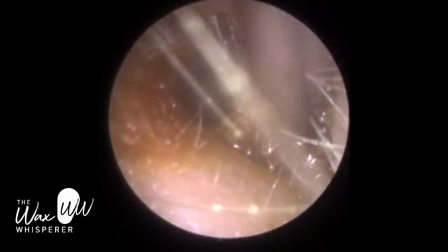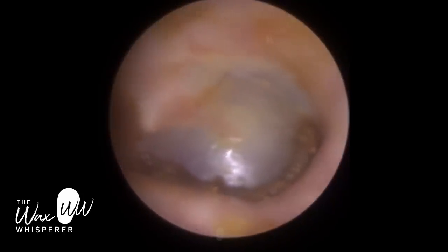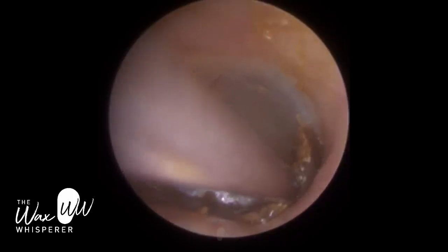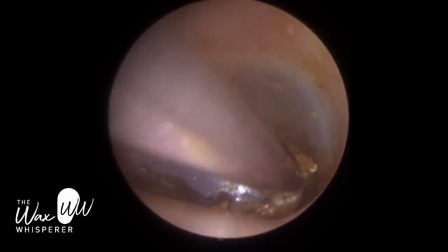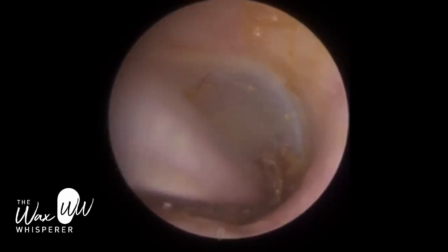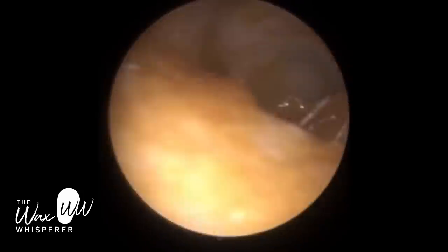The patient's ear canal entrance is quite narrow, so you can see some of the wax got stuck as I was retrieving it. There's the patient's tympanic membrane. There is some wax in the annulus region — that's at the bottom of the eardrum, also called the inferior recess. There are recesses around the eardrum because the ear canal narrows about half a centimeter away from the eardrum, then expands and protrudes back outwards, causing little crevices, trenches, and recesses. I'm delicately using a fine end tip to remove that wax from the annulus region.